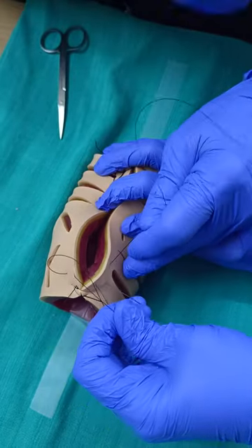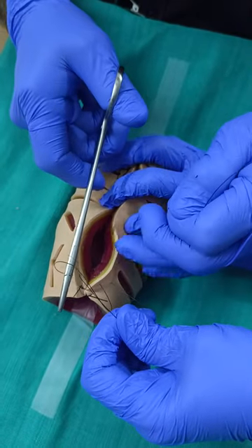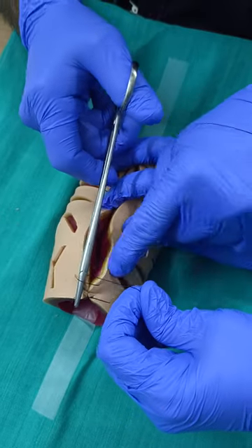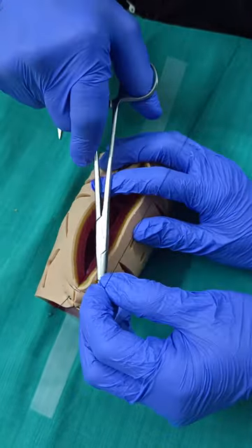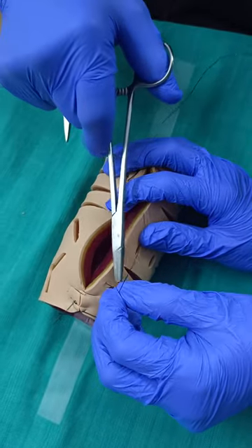Now there will be two loops. You have to tighten this caudal loop. For that, you make this loop short, use the needle holder and tighten this, and pull like this. This is the way it should be tightened, and the traction will be given by the assistant only on this after tightening this.